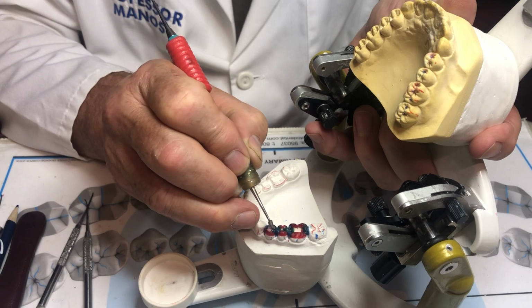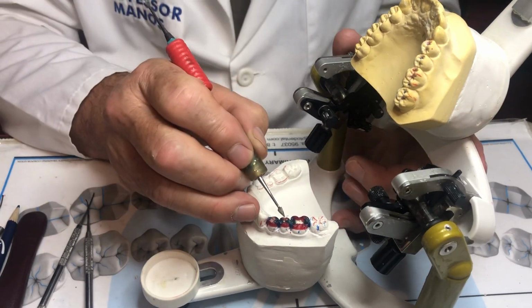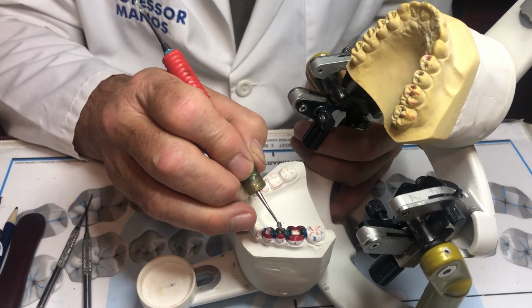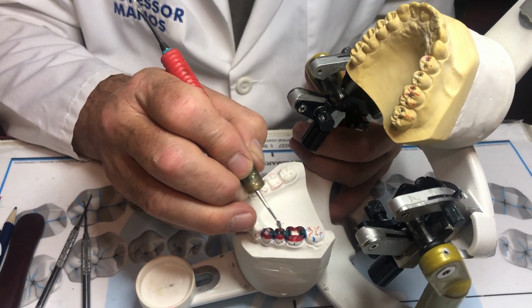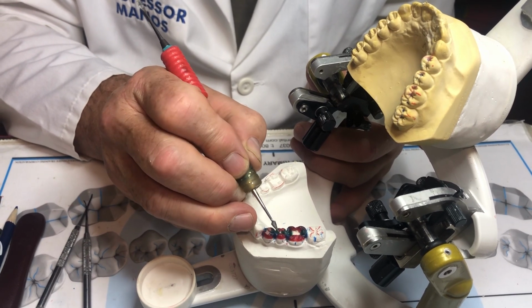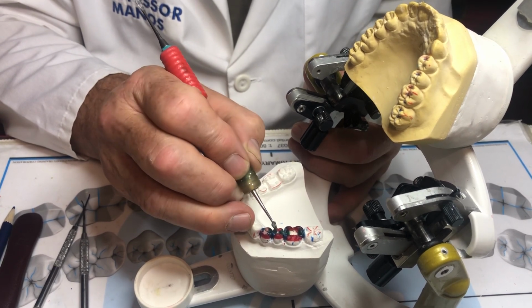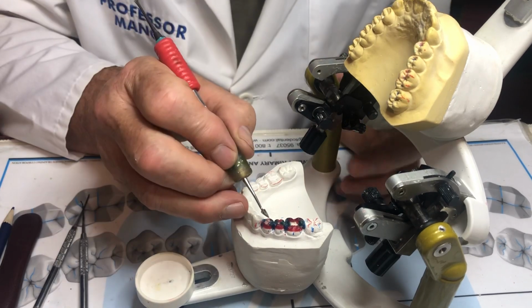Here you're pretty much going straight across, but on the second one, when you accentuate the anatomy, the secondary grooves, you will not go right to left. You'll come down, down, down, and that'll leave you with 3 pits, right? But I think you're capable of doing that.